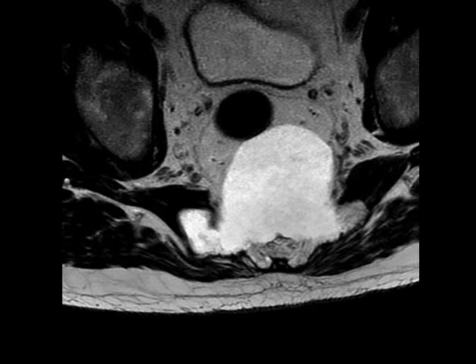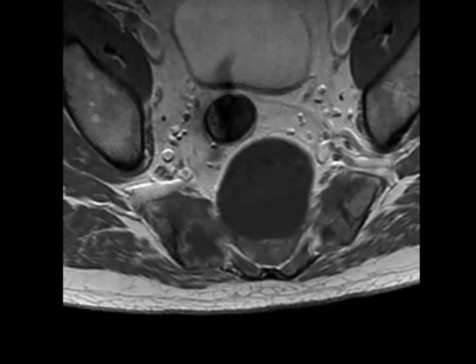Here's a case of a patient with a pelvic mass. On the MR images with T1 and T2 weighted sequences, you can see that this mass, which is arising from the sacrum, is incredibly T2 bright but relatively homogeneous, and pretty homogeneously T1 hypo-intense.